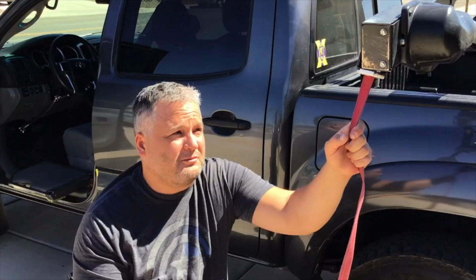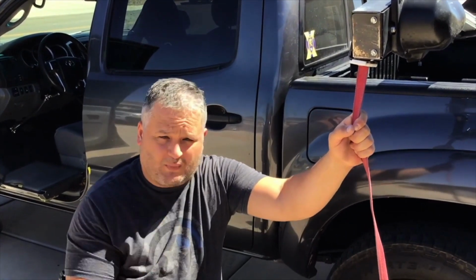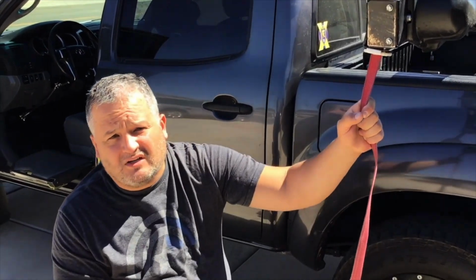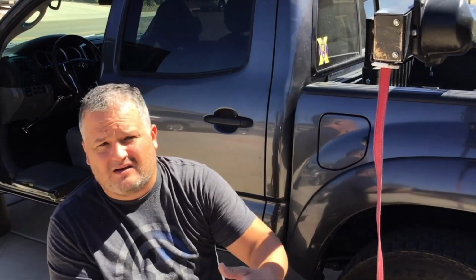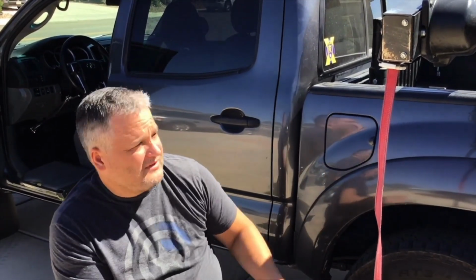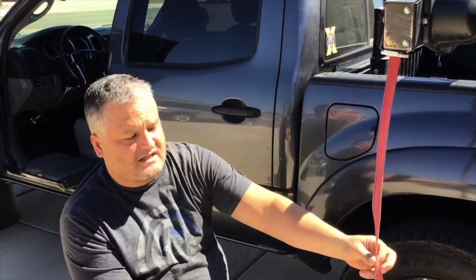One of the nice things that would be really beneficial is to be able to get my vehicle prepared and ready for me to get in before I actually get to the vehicle. So I can get out of the sun like today, or the wind, or the rain, or the snow, all those elements you want to get out of quickly. I can get the vehicle prepared for me to come out. So it'd be nice to be able to open the camper shell and swing the arm out and get it ready to take the chair.